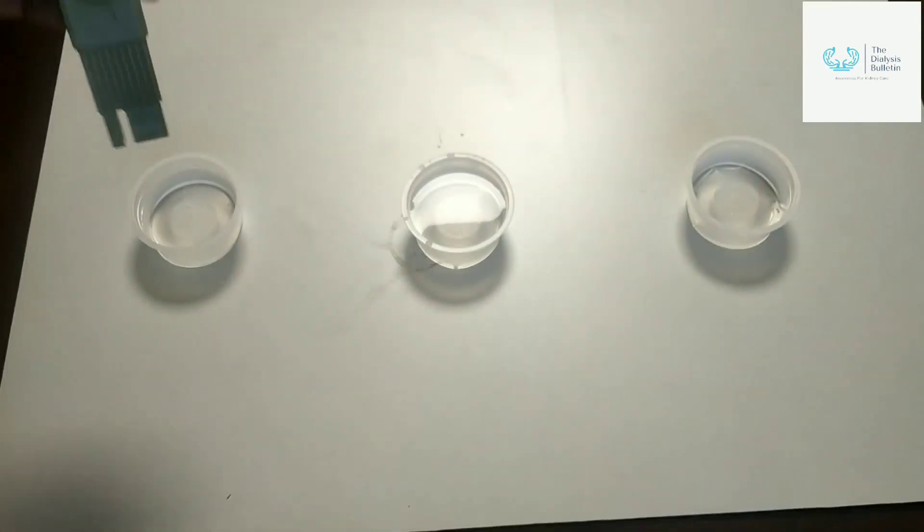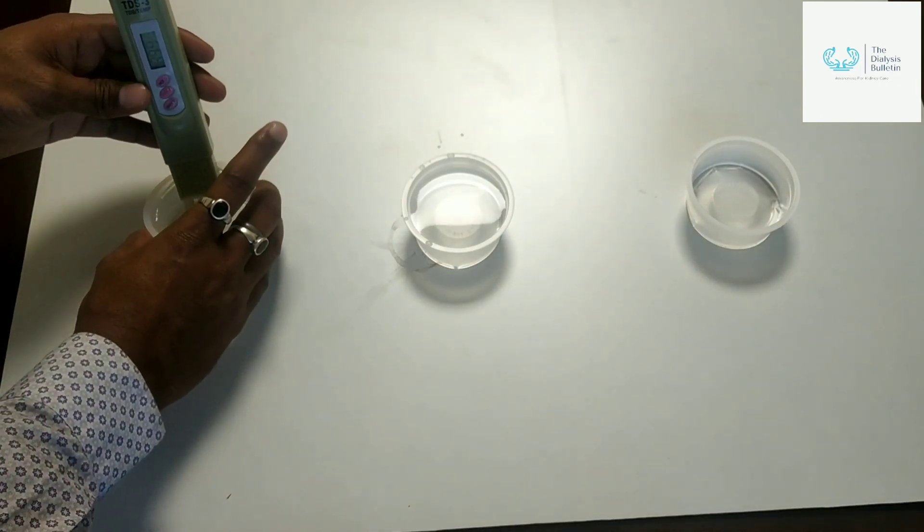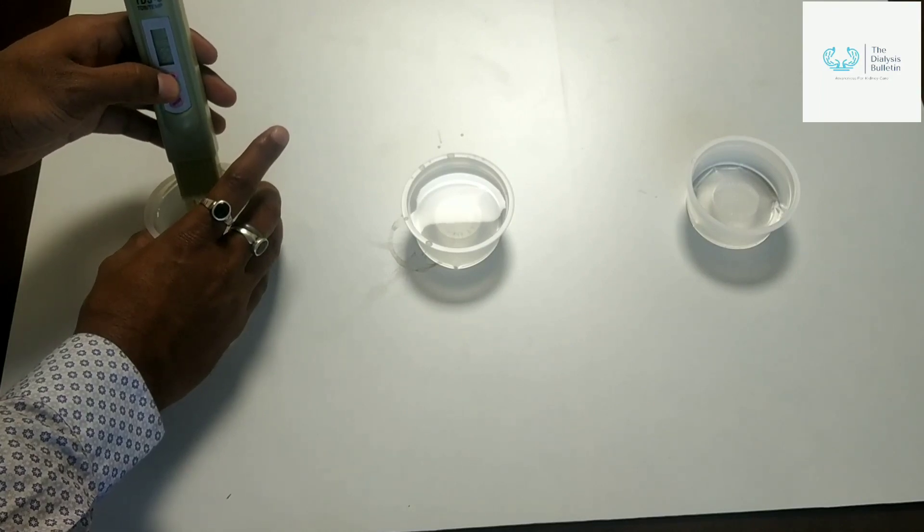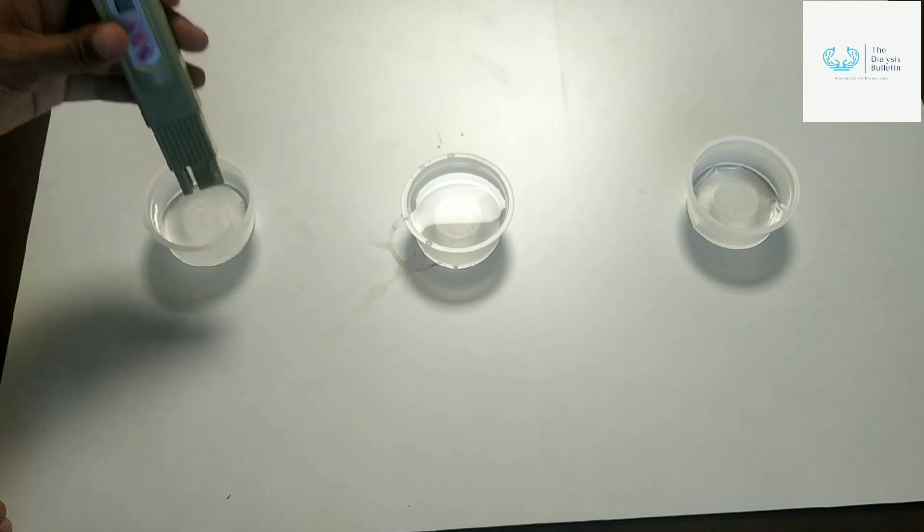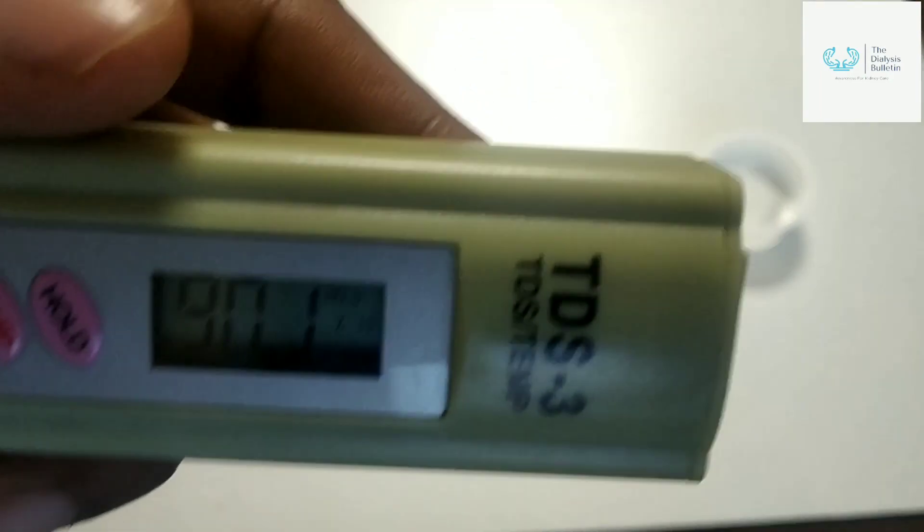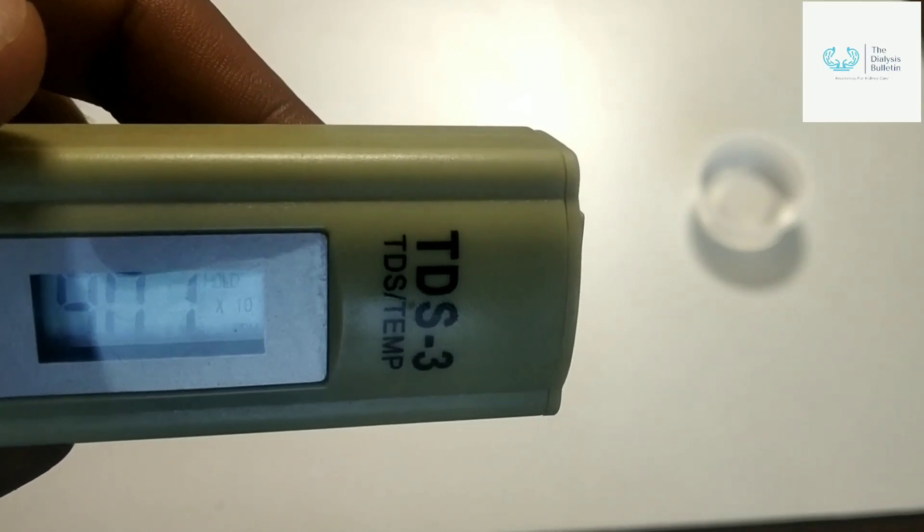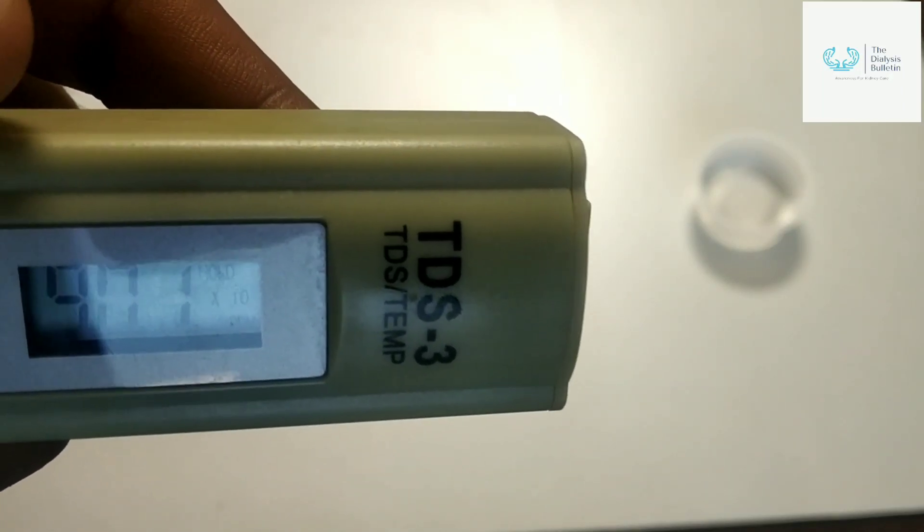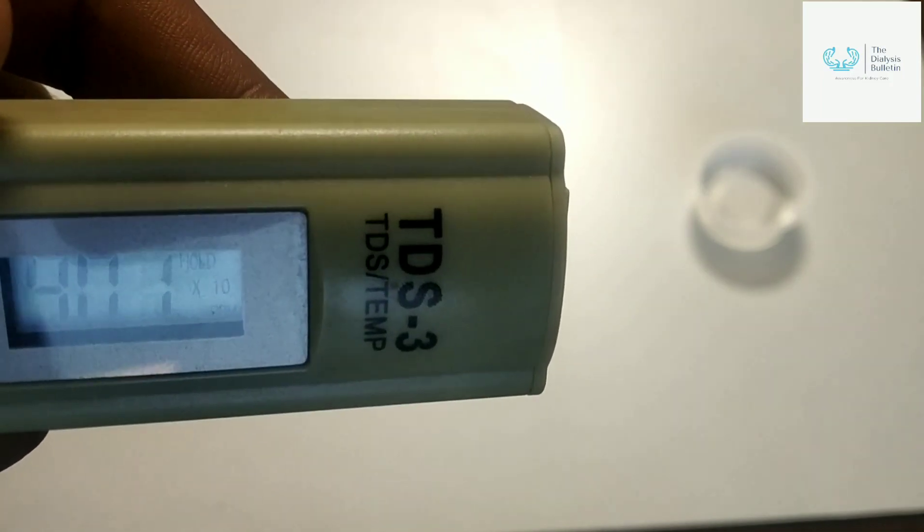Right now it's zero. You have to dip the TDS meter, and right now I am holding. So now you can see that 901 into 10 PPM, that means 9000, approximately 9000 TDS.